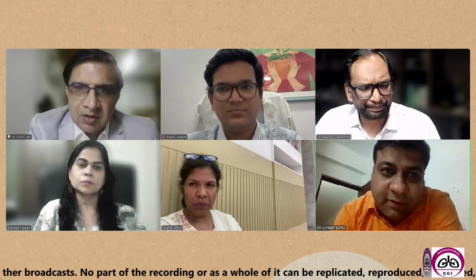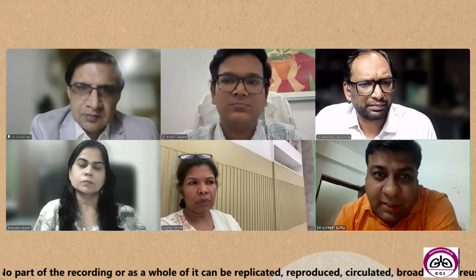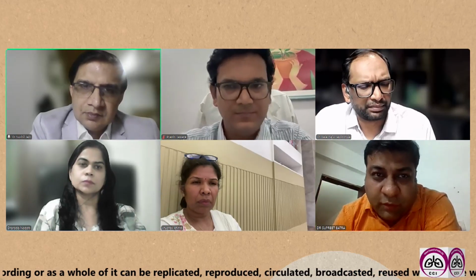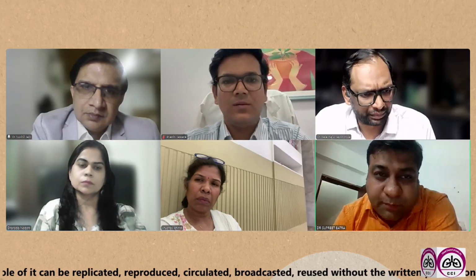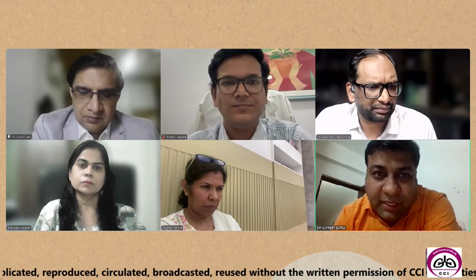Yes, sir. If we are suspecting a malignancy, definitely we don't target the necrotic part. We target the solid part. But if it is a fully necrotic node, then we try to do a suction first to see if there is some pus material or not. In that case, we get a good sample yield.